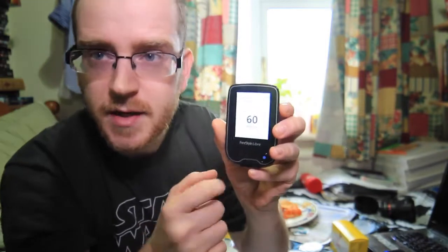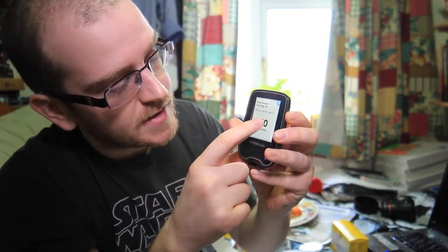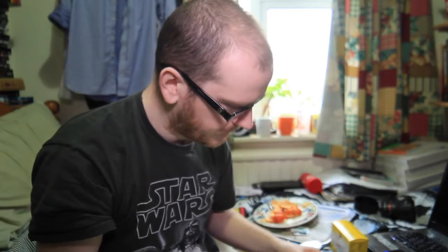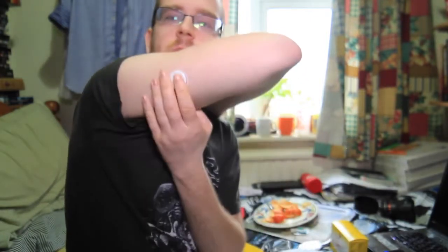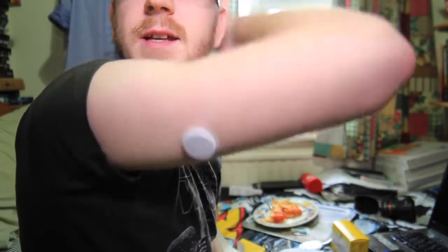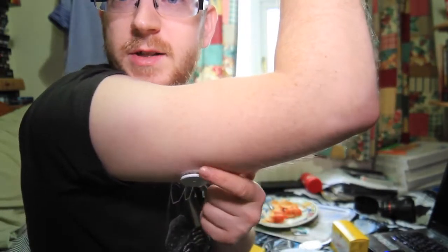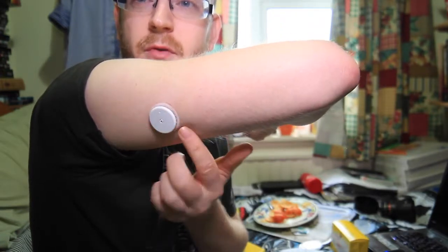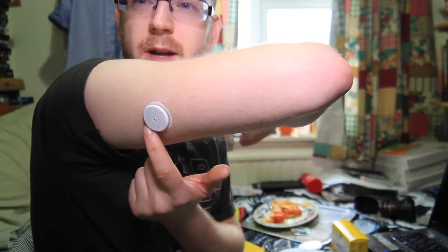I bring the reader close to my arm and it now says on screen: 'New sensor starting up — sensor can be used in 60 minutes.' I click OK. So in about 60 minutes I can come back and use this. Looking at it up close — it's quite small, about the size of a large coin. It lasts 14 days and has enough battery for 14 days.